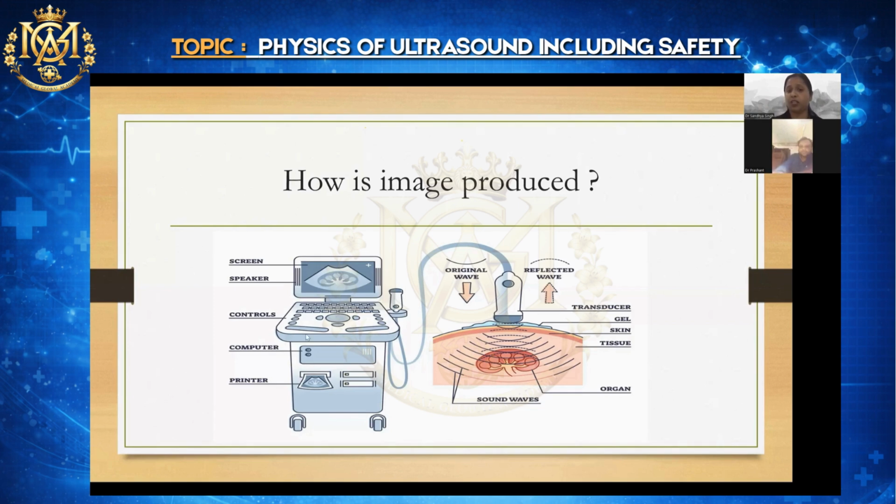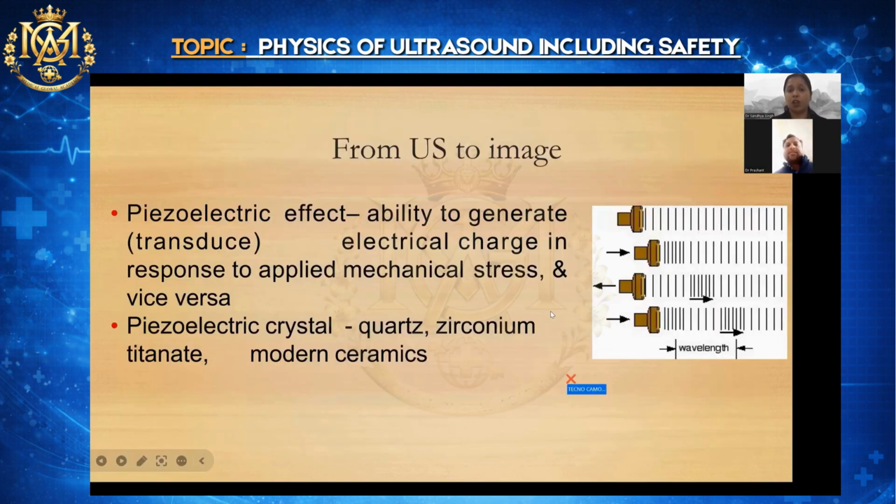And what you see here as a medium, which helps this mechanical wave enter the organ of interest, is the gel which you use during your scans. I told you this piezoelectric crystal is made of quartz, zirconium, and what they do is transmit mechanical to electrical and electrical to mechanical energy.